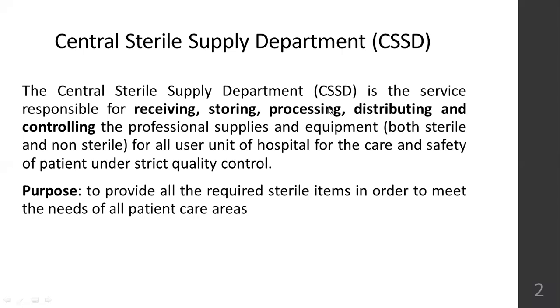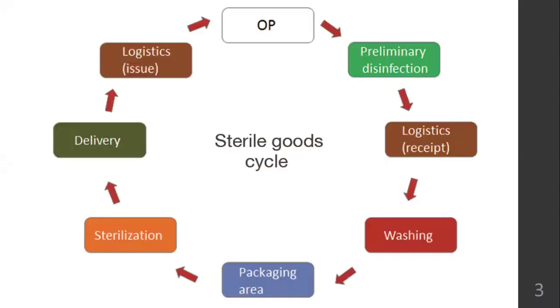Okay, and their main purpose is to provide all the required sterile items in order to meet the needs of patient care areas. Okay, anywhere in the hospital where patient care is done, any department associated with patient care will receive processed sterile supply from the CSSD, and they will give back non-sterile or used articles to the CSSD after proper decontamination. Okay. So this is the cycle.